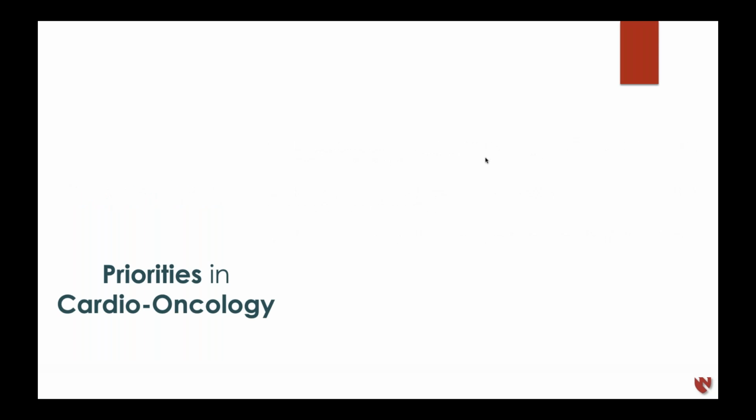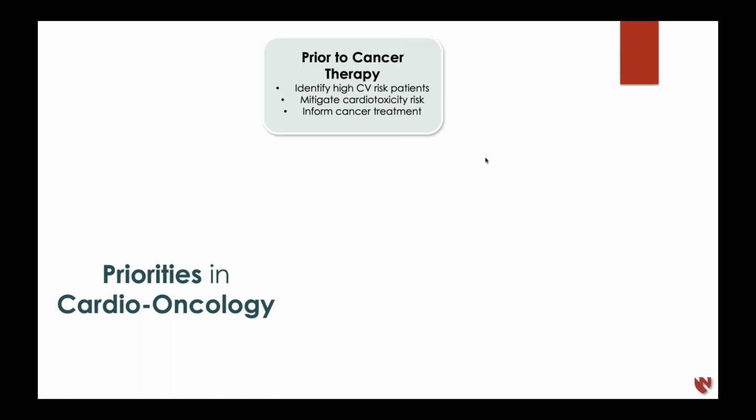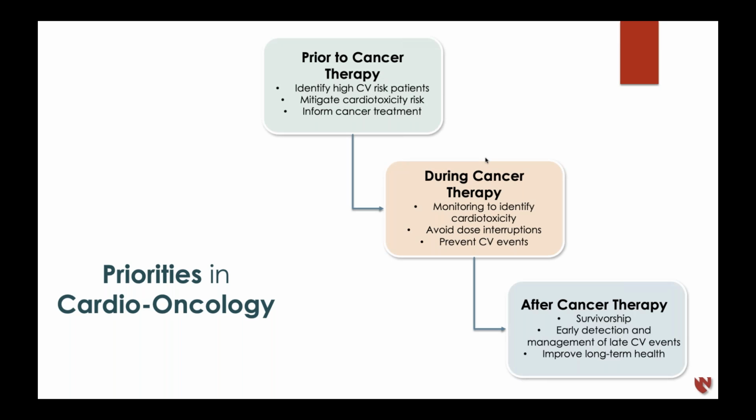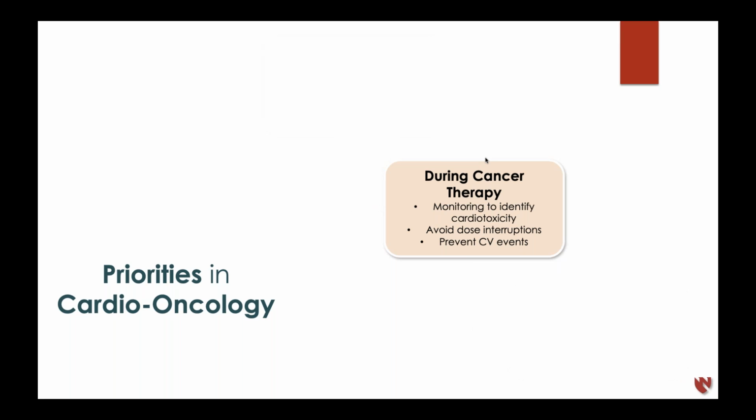So, all right, to give us some context of where this all fits in cardio-oncology, it's important to know that in cardio-oncology, we're looking at our cancer patients who are high risk for developing cardiotoxicity from their chemotherapy or already have pre-existing cardiac risk. We look at patients before cancer therapy, during cancer therapy, and after cancer therapy, different components to each of those stages. What we're going to be talking about most today is during cancer therapy and how we can use cardiac MRI to monitor for cardiotoxicity.